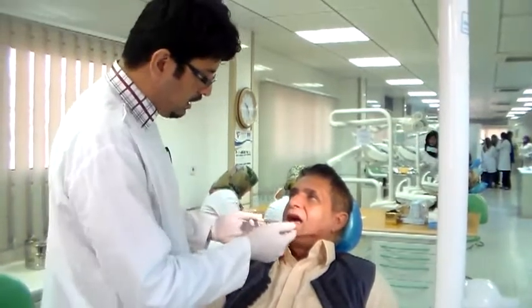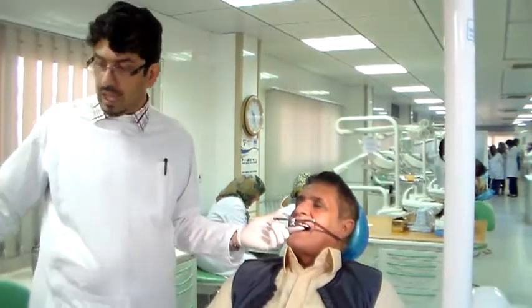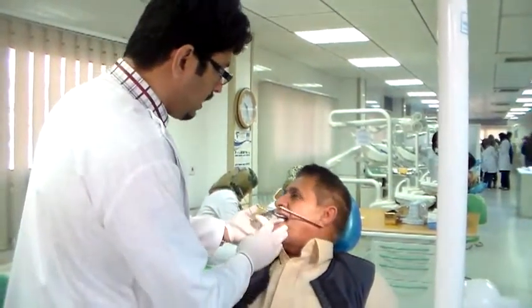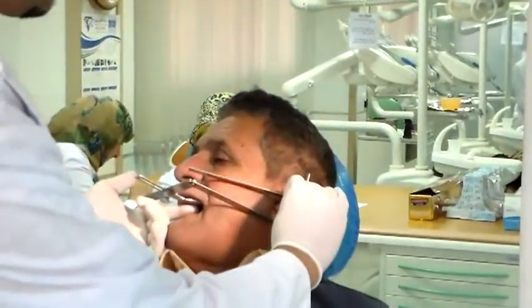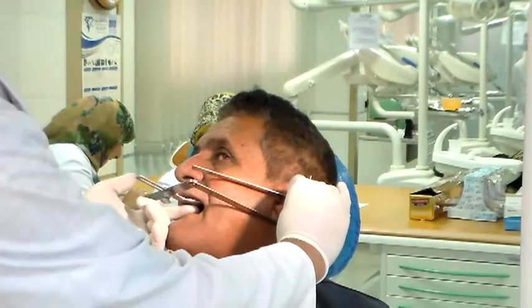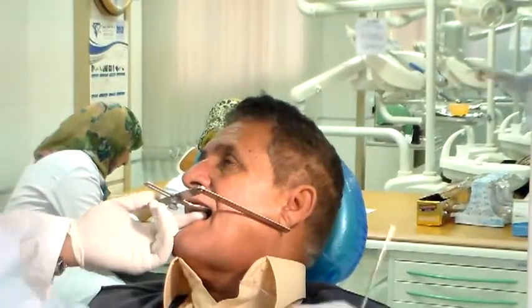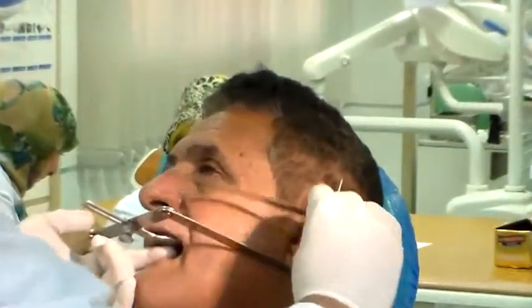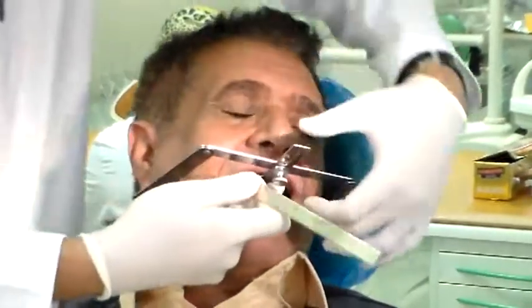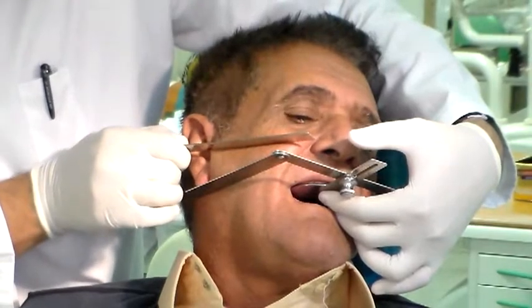Place it back to the patient. Going with my fox plane, checking for the posterior part — Camper's plane. Turn the face around again and now you see the arm is lifted up. You take ala-tragus and it is parallel. Now I got it right. You take ala-tragus on the other side as well and it is parallel.